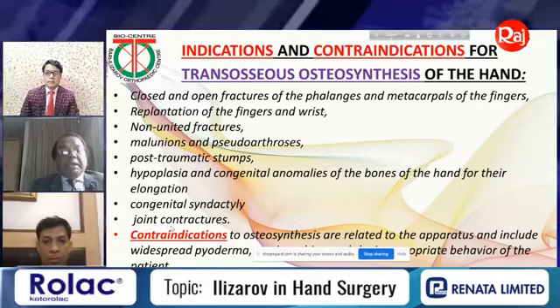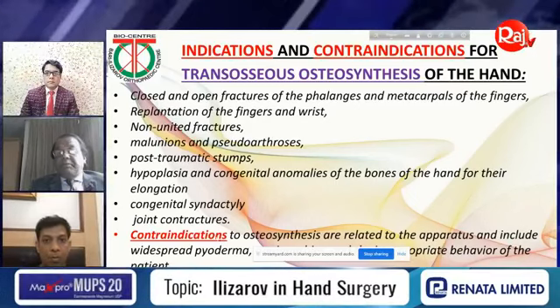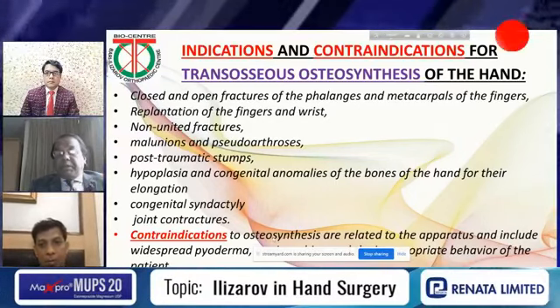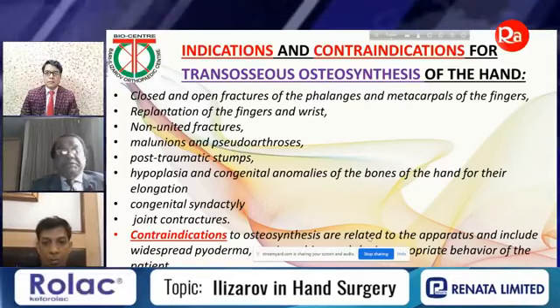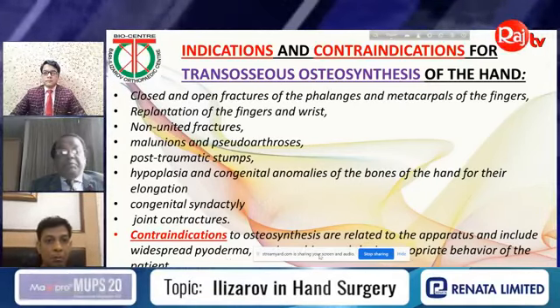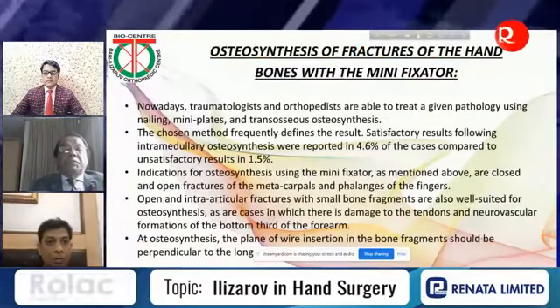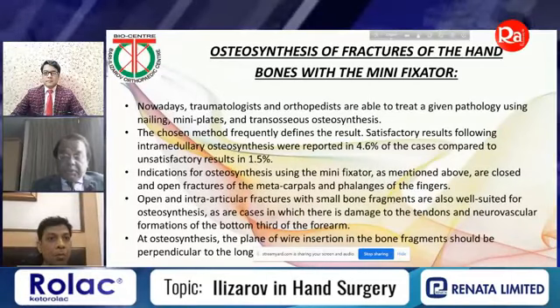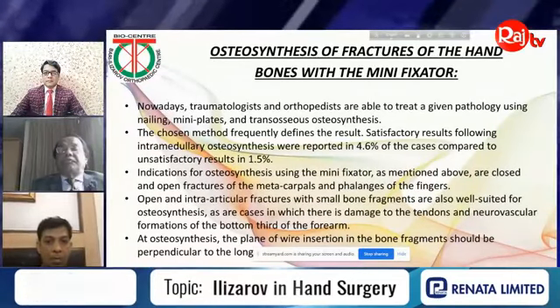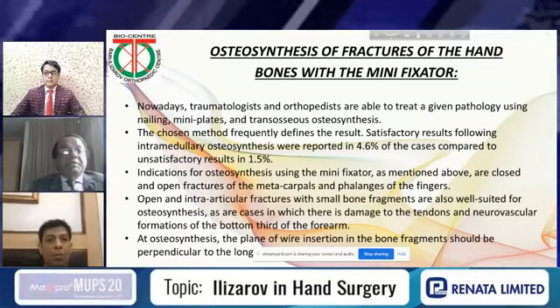Whenever we are talking regarding the contraindications, these are related to the apparatus, including the widespread pyoderma and inappropriate behavior of the patient. You can see here, whenever you are thinking about the osteosynthesis of fractures of the hand bones with a mini Ilizarov or mini fixator.